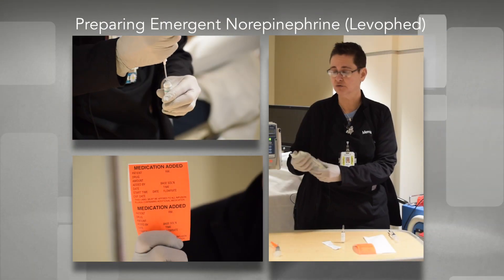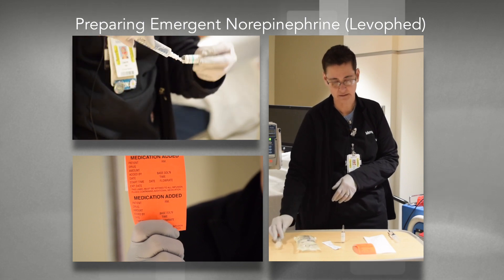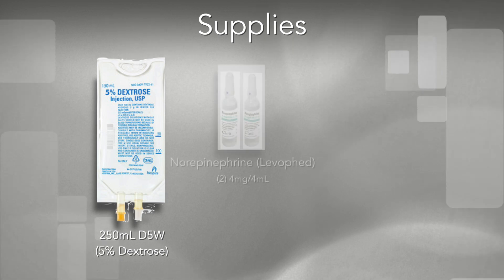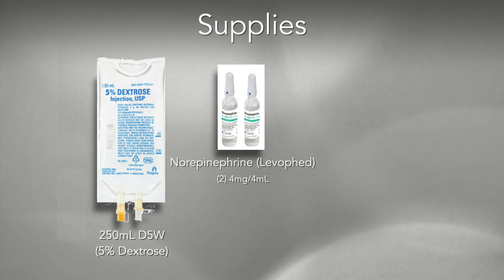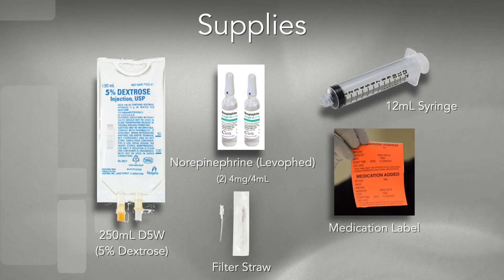This video is going to demonstrate mixing norepinephrine, or Levophed, in an emergent situation. You're going to need a 250ml D5W bag, and the norepinephrine — it comes four milligrams to four mils. In the ICU the concentration is 8mg in 250ml, so you're going to need two of these vials. You'll also need a filter straw, a 12cc syringe, and the orange sticker to write on the medication.